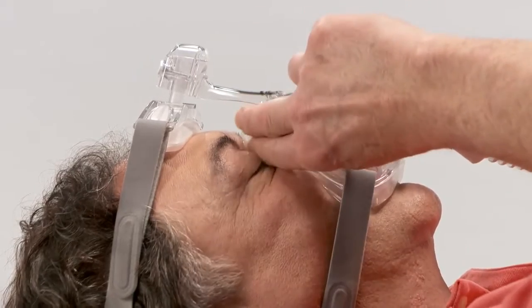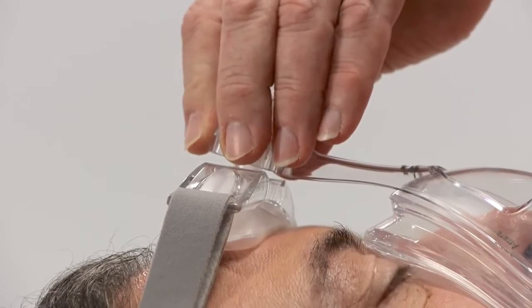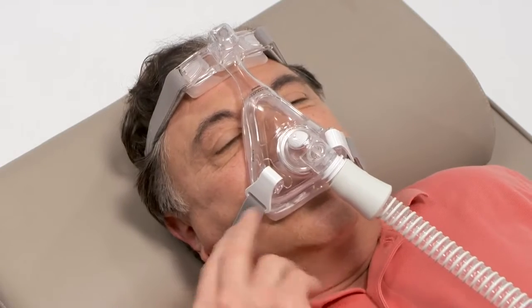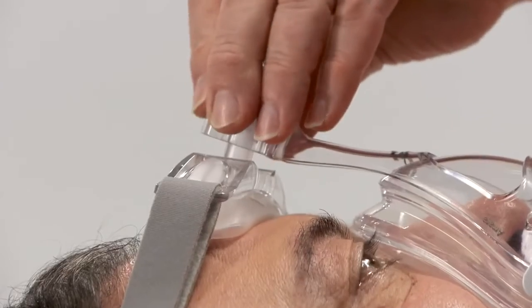To address leaks around the bridge of the nose or into the eyes, press and hold the fine glide adjuster to increase pressure in this area. To correct leaks around or below the mouth, press and hold the fine glide adjuster to increase pressure in this area.